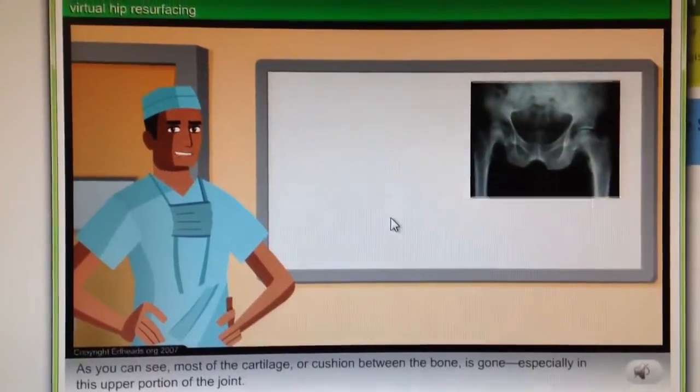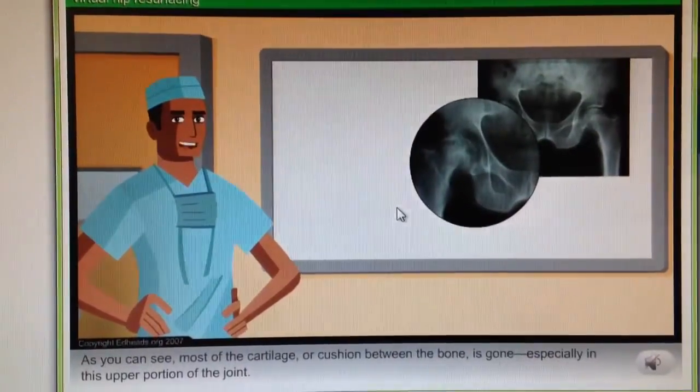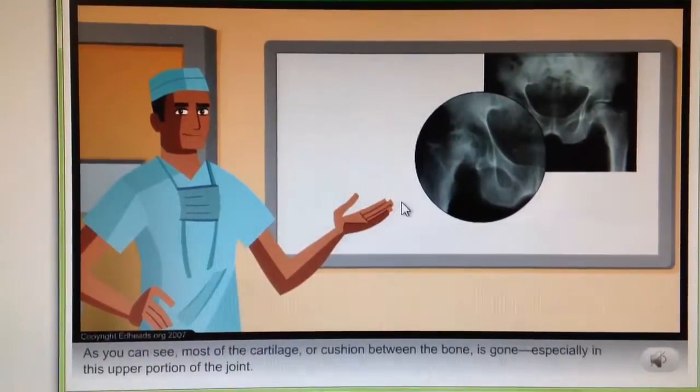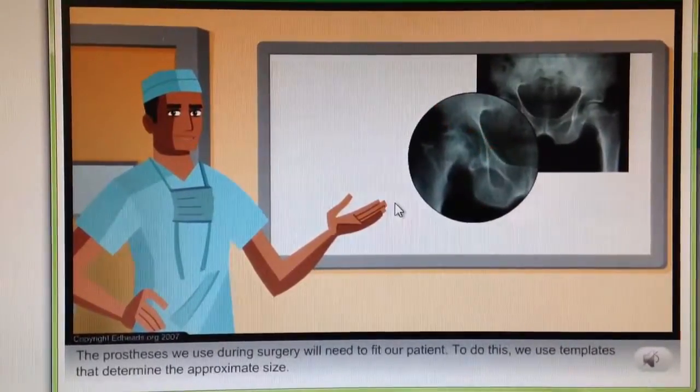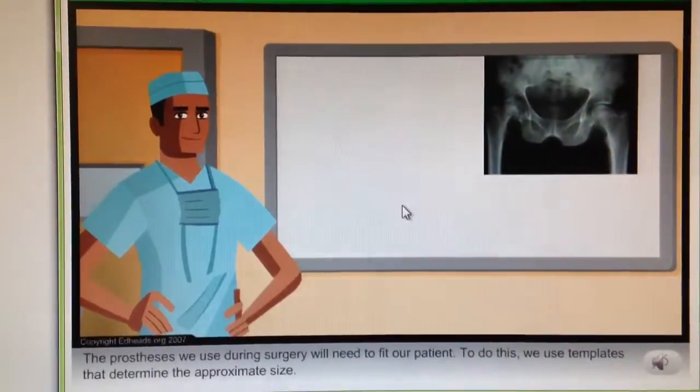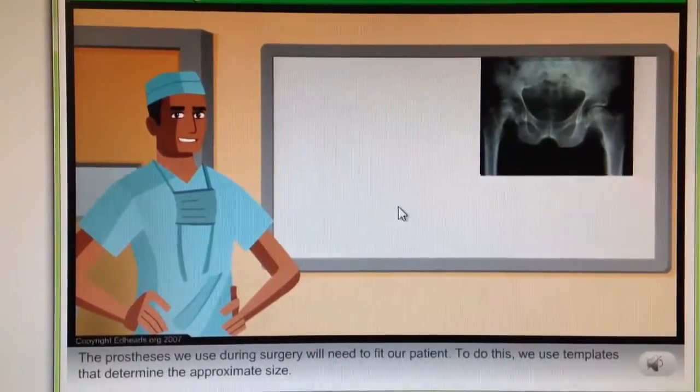That's correct. As you can see, most of the cartilage or cushion between the bone is gone, especially in this upper portion of the joint. The prosthesis we use during surgery will need to fit our patient. To do this, we use templates that determine the approximate size.